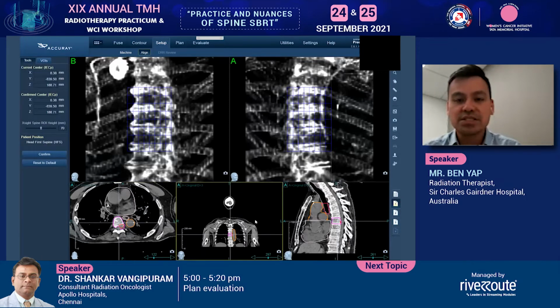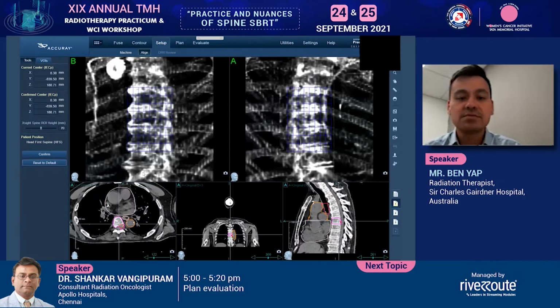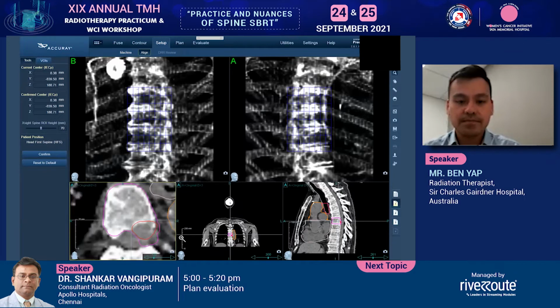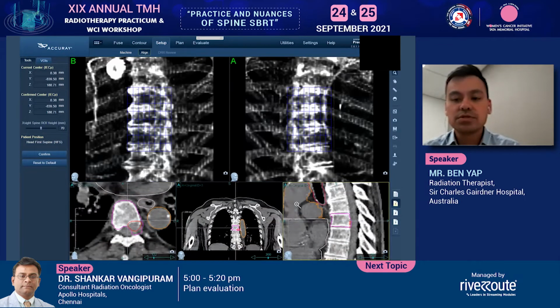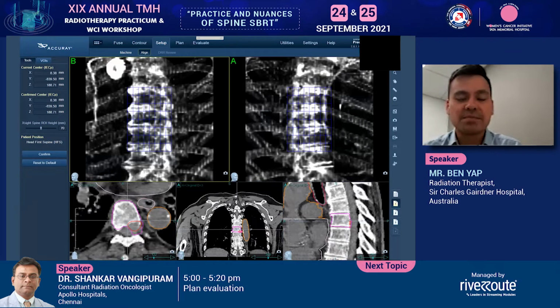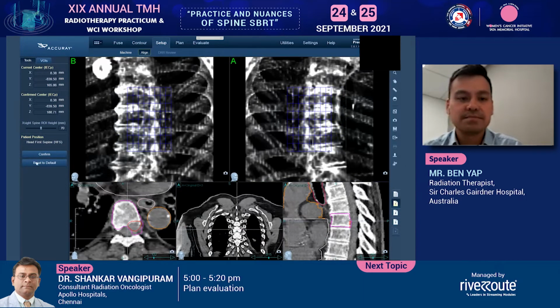And then what you can do is you can adjust in your coronal or sagittal until you achieve the best possible aligned mesh, as you can see. And our advice for the mesh is minimum, and this is also Accuray's advice, minimum, try to get 3 vertebrae, try not to have the center in interface. So you can see here that's actually in the bone. You don't want it to be an interface where there's tissue or spinal cord and there's bone. And you also want to try to have as much spine anatomy as possible. So you don't want to have, for instance, bits of lung. Okay.